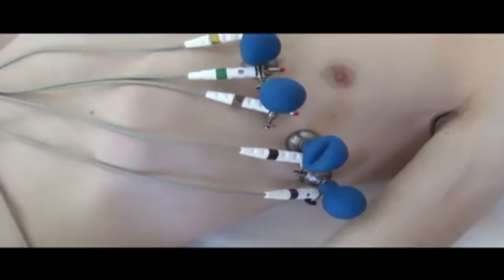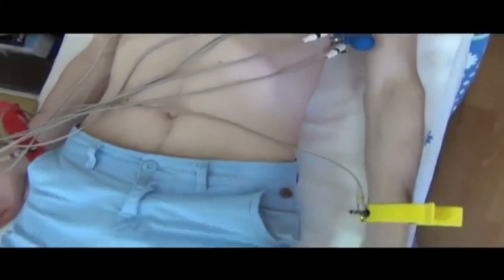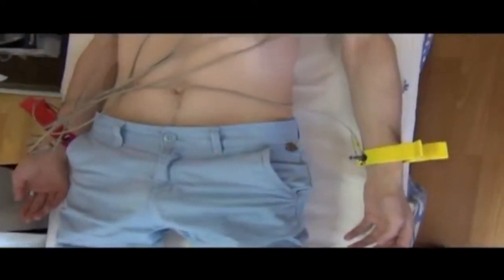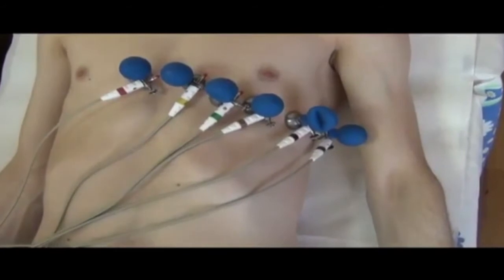Next, we should check if electrodes are placed correctly: red on the right arm, yellow on the left arm, green on the left leg, black on the right leg. Then we check if the chest electrodes are placed correctly. After this, we start registration of ECG.